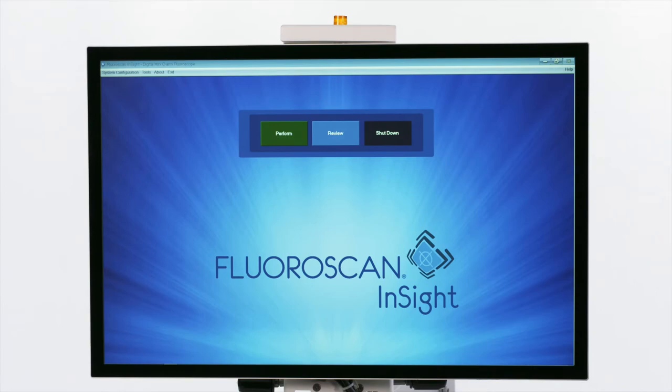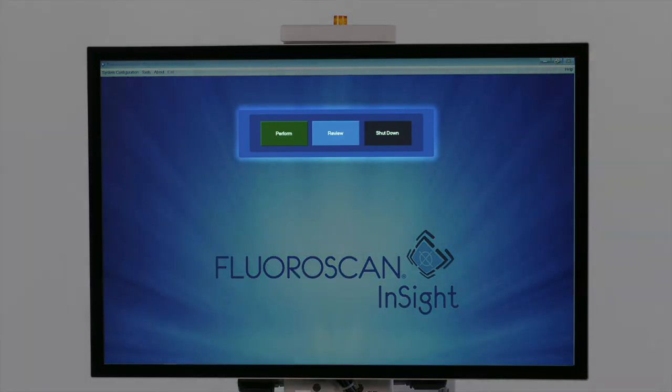We will now look at how to use the software. The home screen has three color-coded buttons: Perform, Review, and Shut Down.